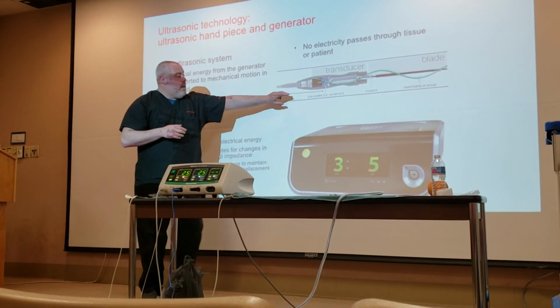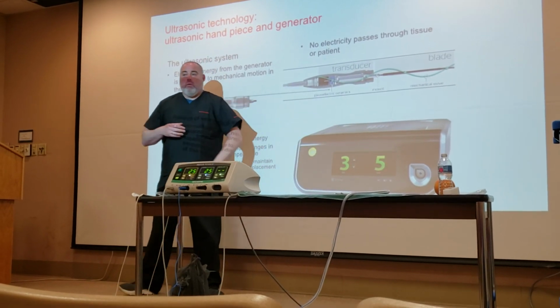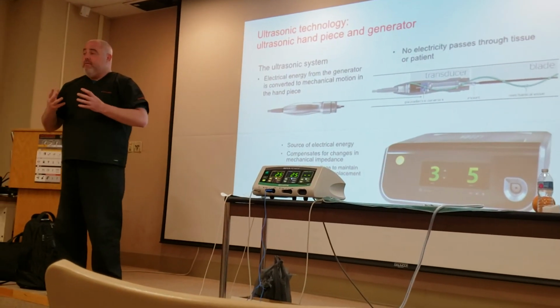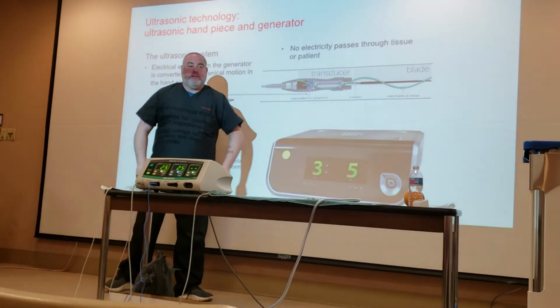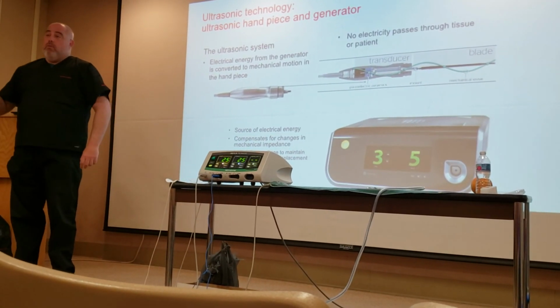Electricity flows through the handpiece and hits these piezo ceramic discs. When piezo ceramic discs are hit with electricity, they get excited and vibrate. And that vibration causes longitudinal movement of a blade at the end of a stick. And that's how ultrasonic technology works. Anyone use a skill saw?